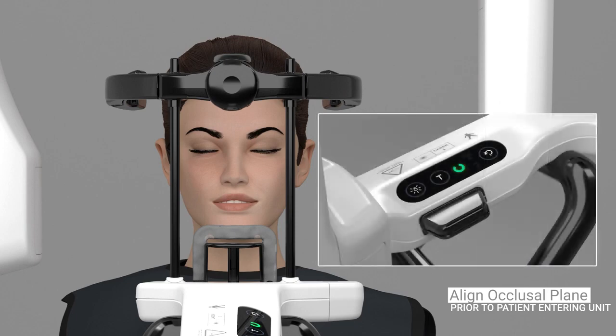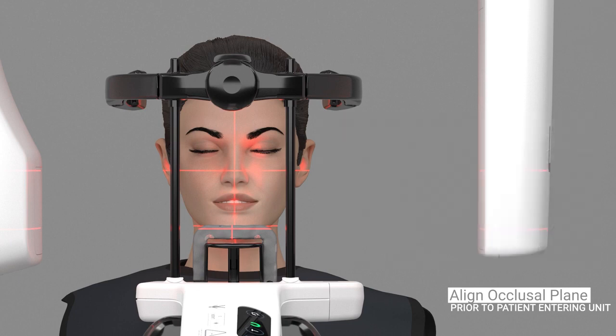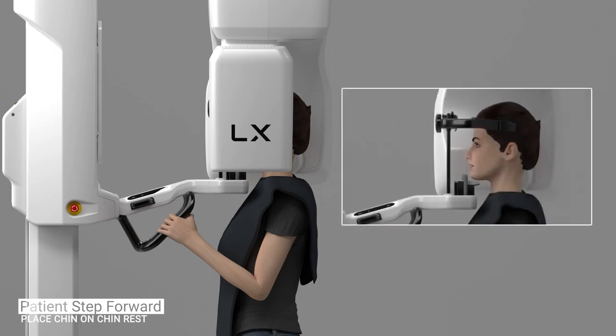Turn the patient positioning lights on by pressing the positioning light button on the control panel. Use the horizontal alignment lights to ensure the patient's occlusal plane is horizontal. Have the patient step forward, asking them to grasp the patient handles. Place their chin on the chin rest, making contact with the lip support.